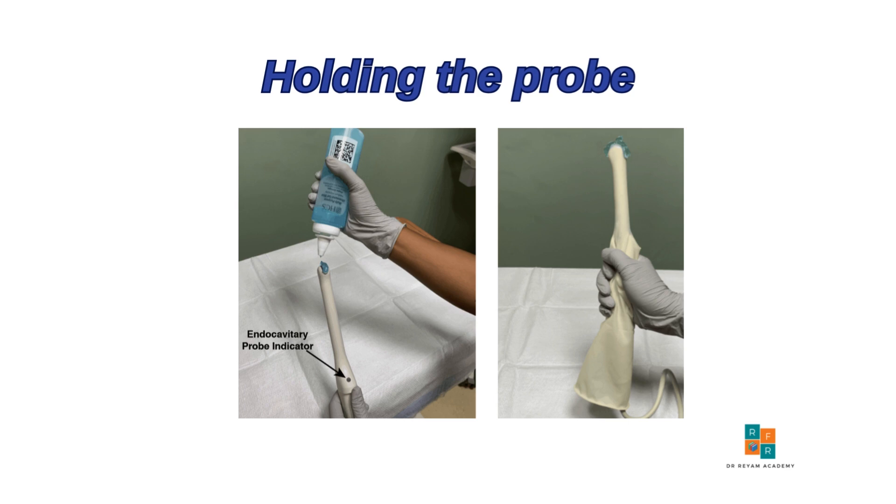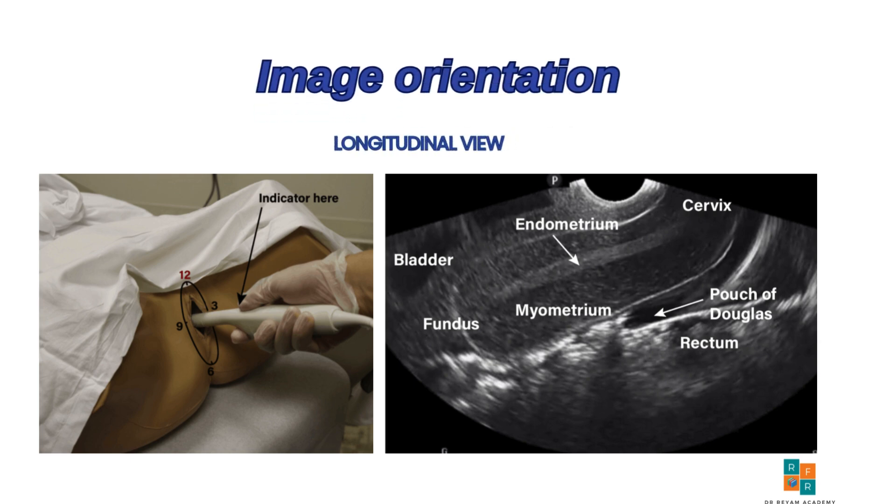To obtain the longitudinal view, the probe is gently inserted into the patient's vagina with the indicator positioned at 12 o'clock. In this sagittal plane, you should be able to visualize the bladder, cervix, uterus, and the cul-de-sac. On the monitor display, the bladder appears in the upper left portion of the screen.